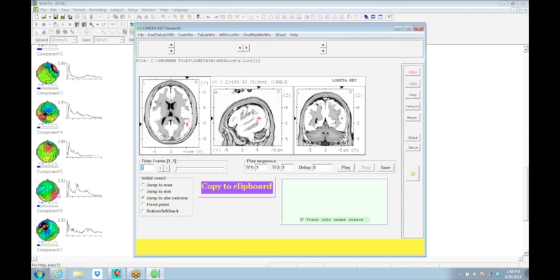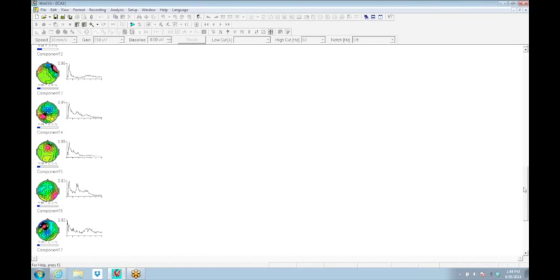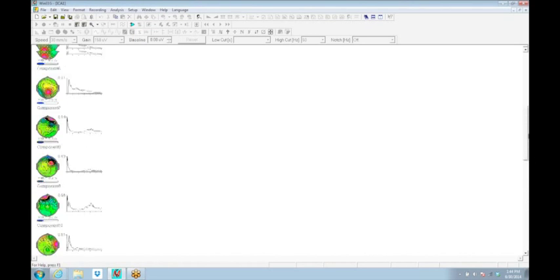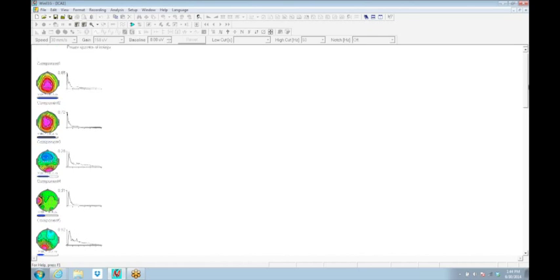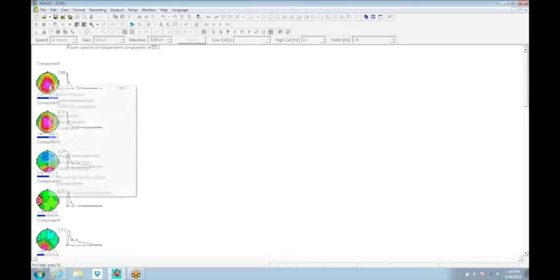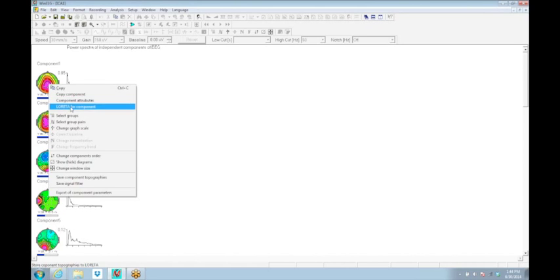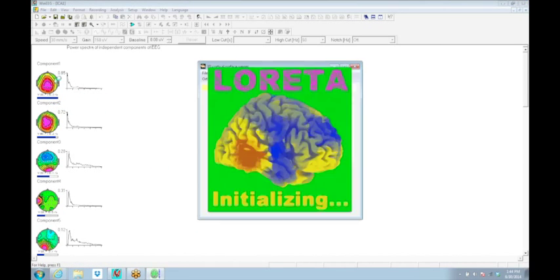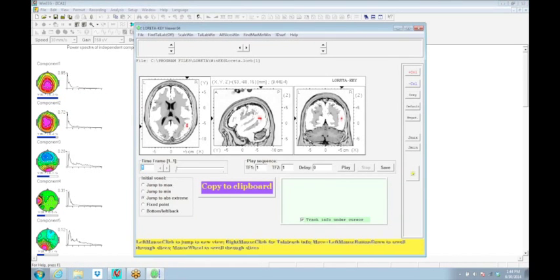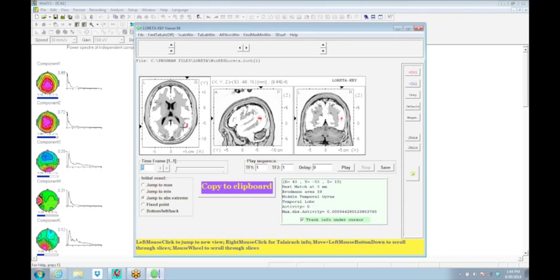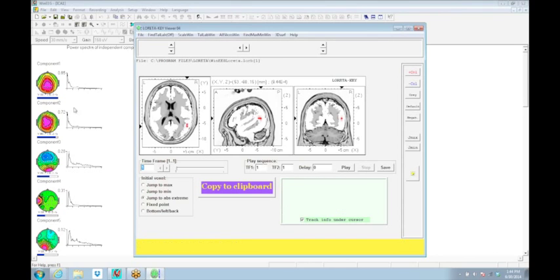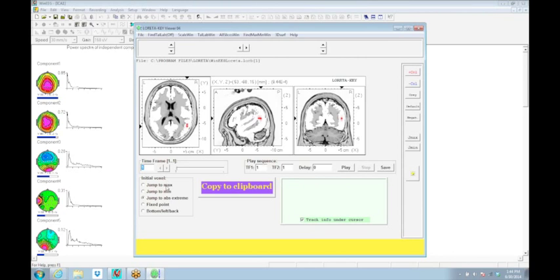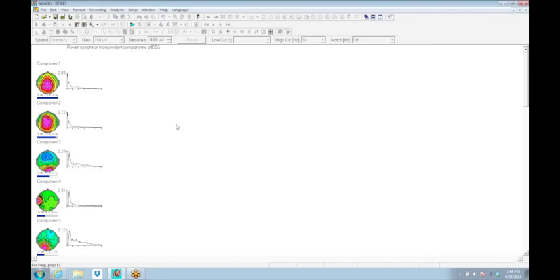Let's say that this was a component that we were trying to get rid of, a right temporal alpha in an Asperger's autistic client or something. If we had done training, this component will either disappear off the list or instead of being component 15, it will drop down the list as it becomes weaker. This only is 2 point something percent of the variance of the EEG the way it is. It's not a big component in the first place. The decomposition of the EEG identifies individual generators. Here's a low grade of alpha with a lot of low grade slowing. It's one of the largest spatial generators. It's basically something coming off the right temporal area as a focal generator.